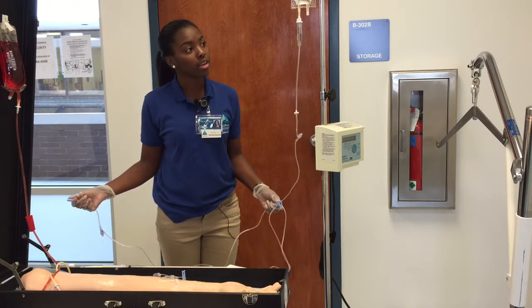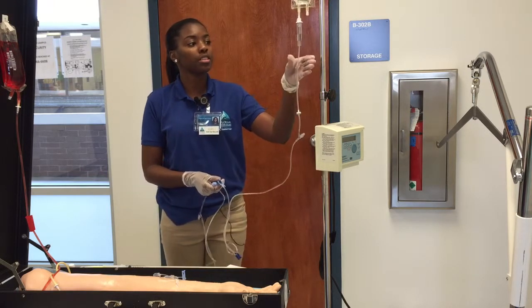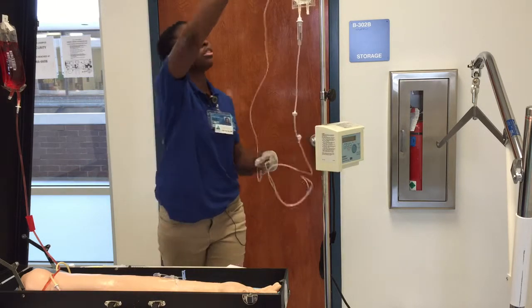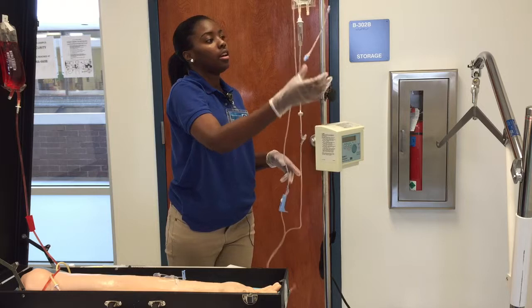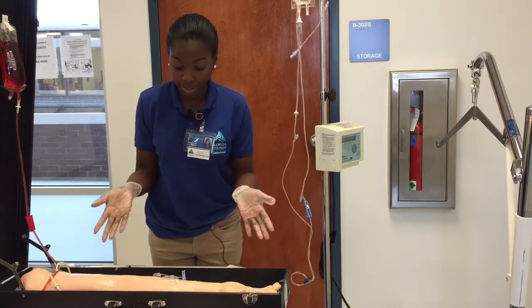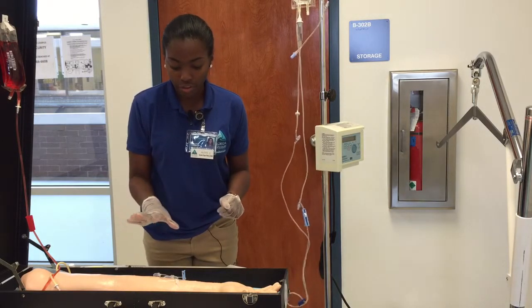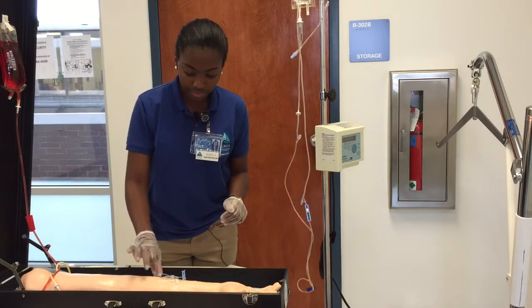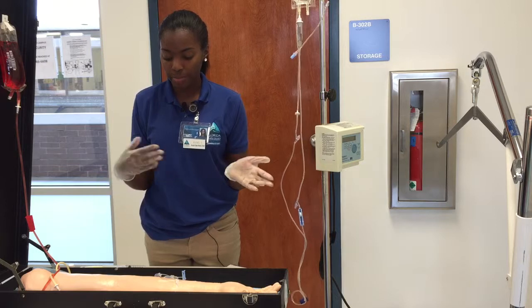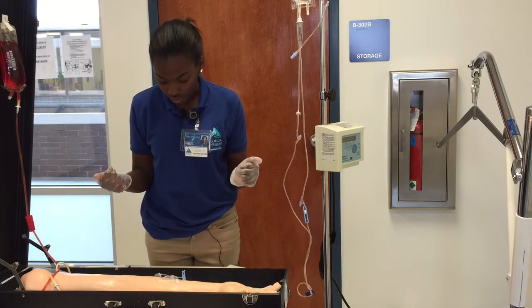Okay, so my tubing is primed, and I am going to label my tube with the date, time, and my initials, and then I am going to just put this here. Okay, and I'm in the patient's room. I'm going to assess the IV site for phlebitis or any infiltration, and make sure if the patient has received the medication before, and if the patient has not received the medication, I'll explain the medication to him and what it's for.